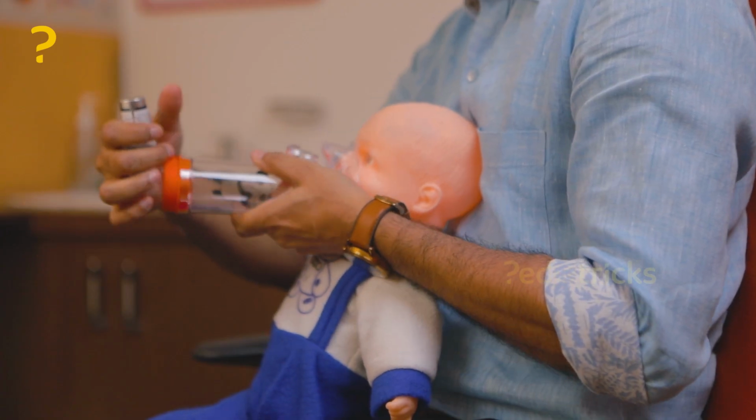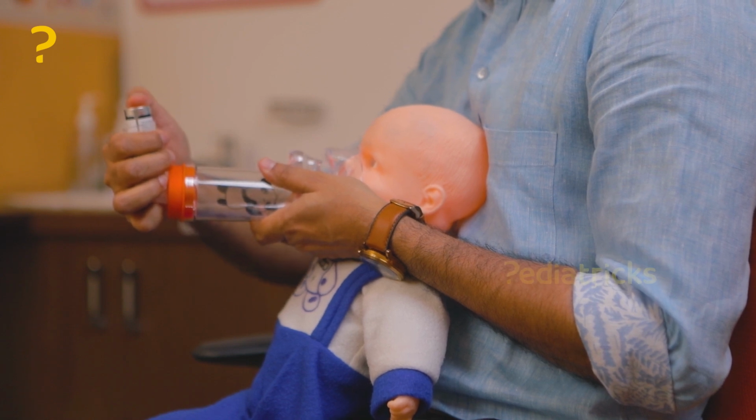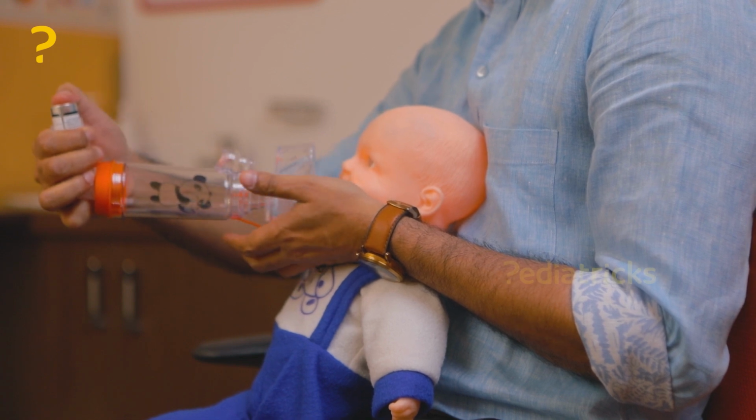For smaller children, you have face masks which have to be tightly placed on the baby's face, covering the nose and the mouth. Then you give the first puff and tell them to take slow deep breaths. Ask them to hold it and count up to 10. Around 6 breaths allow the puff to be completely inhaled through the spacer. Have them slowly breathe out, and if you want to give more puffs, give a 1-minute break and then repeat all over again.